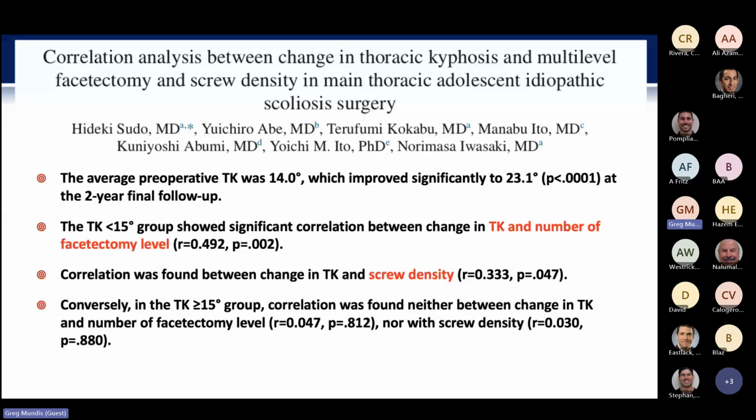And in this case, she had more of a coronal deformity. Her thoracic spine in the sagittal plane did not look very bad. And even when we opened her up and looked at her, in real time, there was really not a terrible amount of lordosis throughout her thoracic spine.